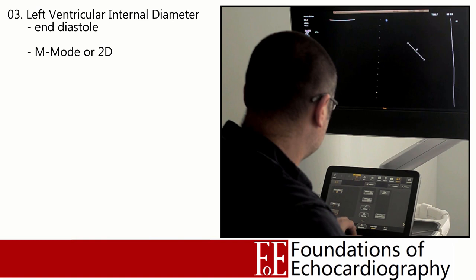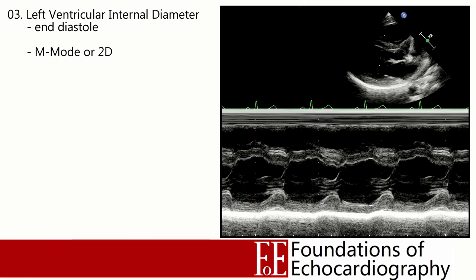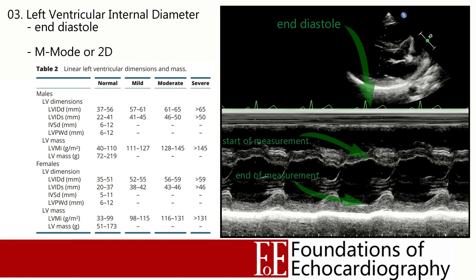Next we're going to measure the LV cavity size — specifically the LV internal diameter at end diastole. You can do this using M-mode or a frozen 2D image. Using M-mode, line the cursor up perpendicular to the LV walls; cutting obliquely will overestimate the cavity dimension. The cursor should rest just beyond the tips of the mitral valve leaflets when open. Use the ECG to identify end diastole, which is just beyond the QRS complex. Measure the internal diameter, ignoring any chordae passing through the area — stopping at a chorda will underestimate the cavity diameter.